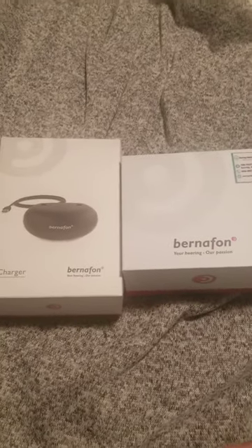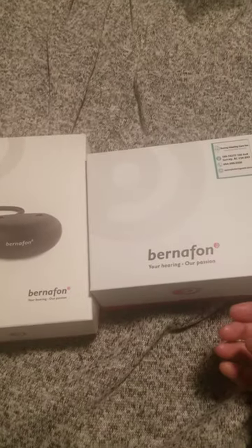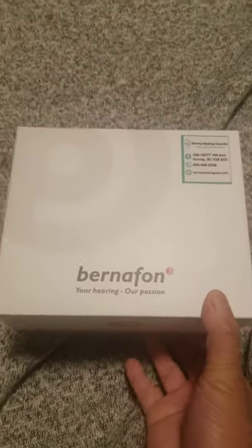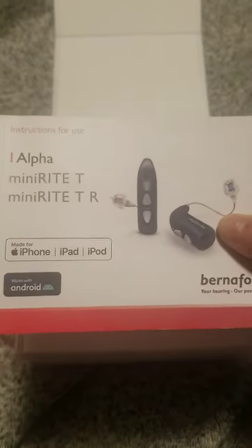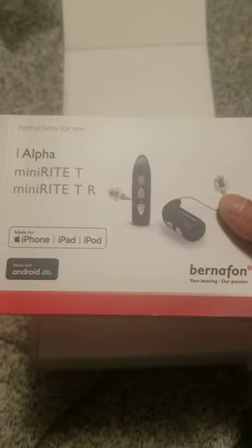Bernafon Hearing Aids Bluetooth Rechargeable, Made in Denmark. This is the Bernafon Hearing Aids Bluetooth Alpha Mini — a quick guide and instruction.